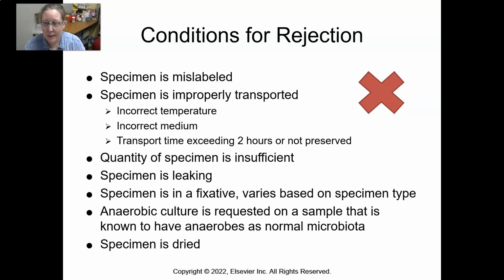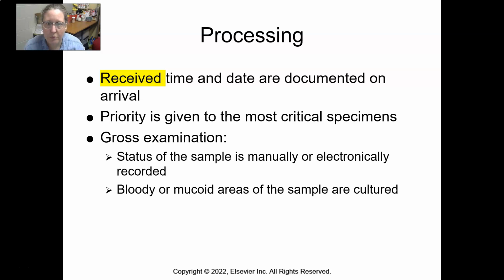If the specimen is leaking, because then of course it's contaminated. If the specimen is in a fixative, and that varies based on the specimen type and what's required. If it's an anaerobic culture requested on a sample that is known to have anaerobes as normal microbiota, like a stool, for example. Or if the specimen is all dried up, because then likely the bacteria are all dried and they're not going to grow.